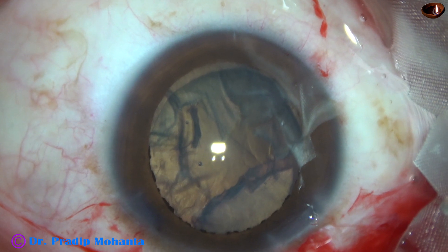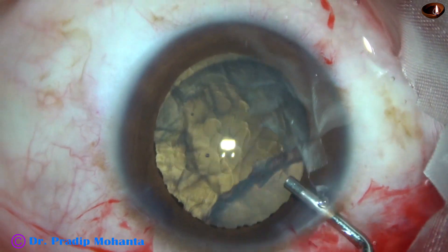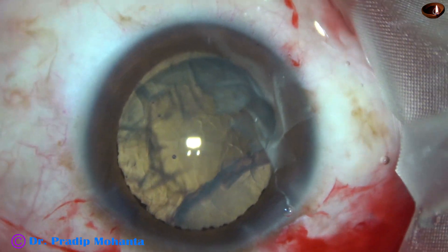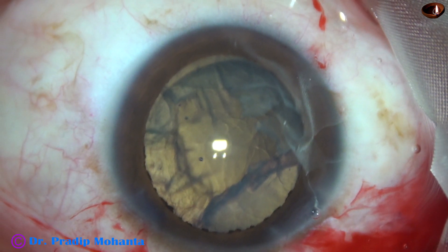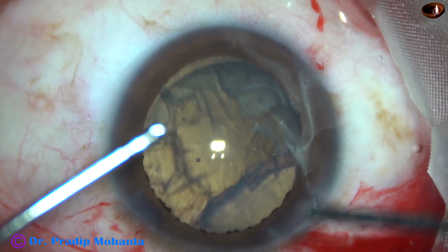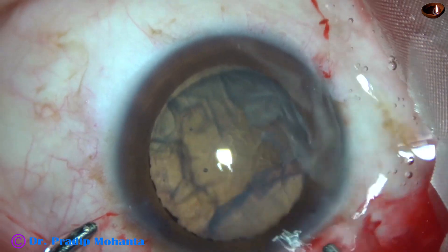The other eye of the patient is having total retinal detachment with atrophic retina and the eye has no perception of light. This eye has hand movement vision and perception of light, and projection of rays present in all four coordinates.